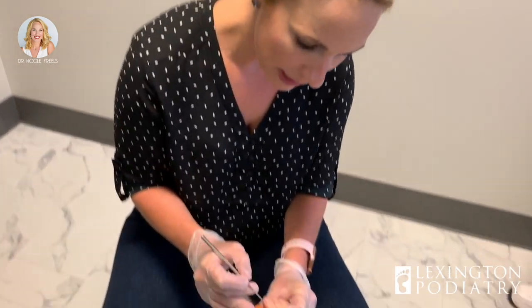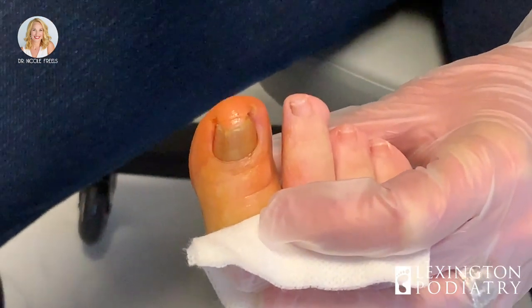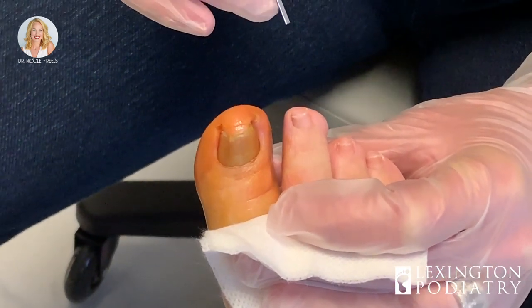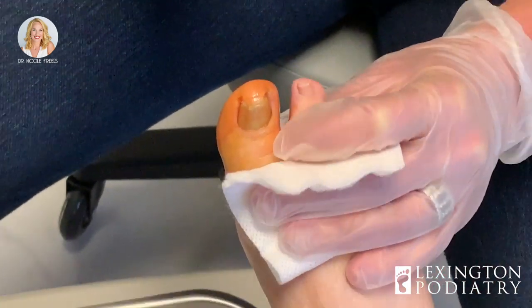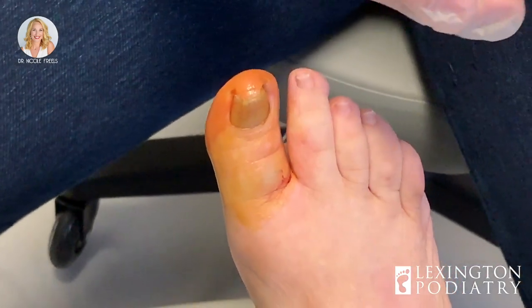We are here going to remove an ingrown toenail. It's a little hard to see because we've already prepped it and applied betadine. There's a small abscess underneath the skin. She was questioning this morning whether she should come in and have this taken care of. What ultimately brought you in? The infection builds up underneath the skin like a bubble — it can't get out, so it becomes very painful.